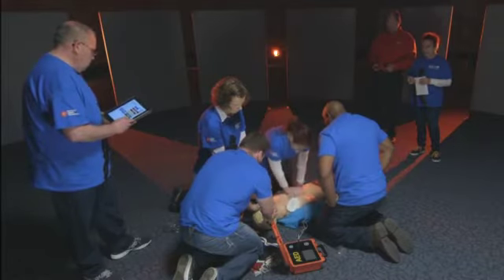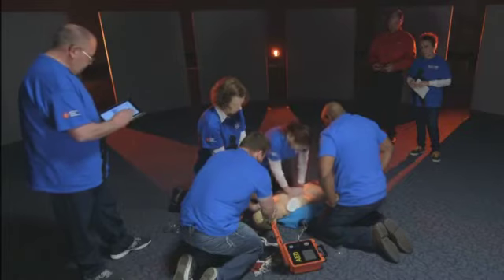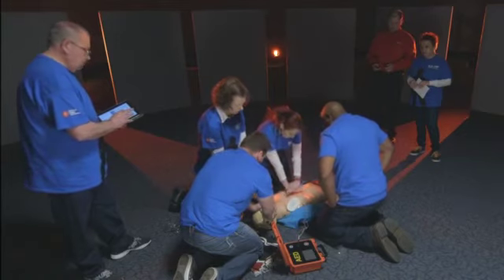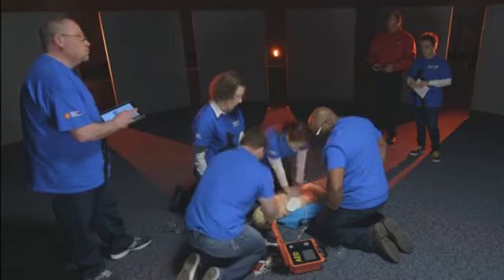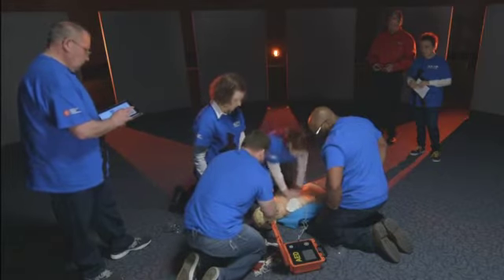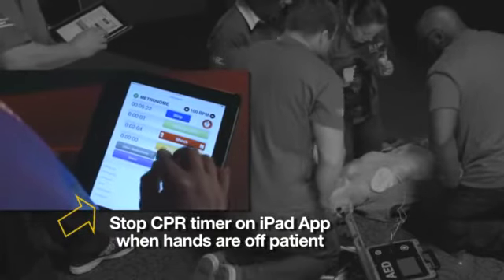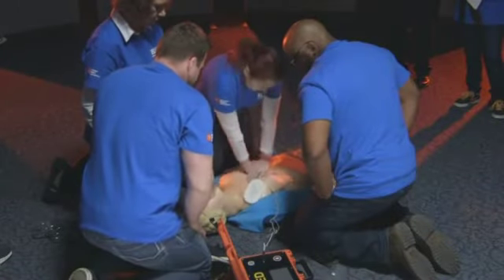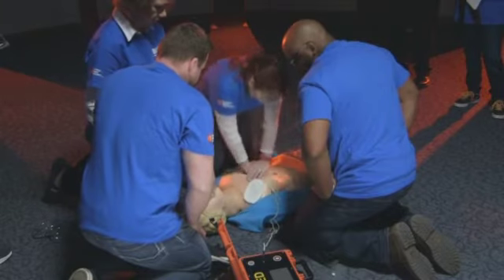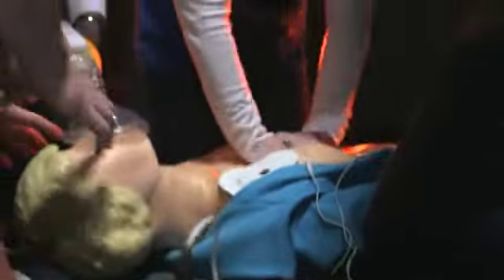Good compressions. Good recoil. Ten seconds to analyze. Analyzing heart rhythm — stay clear of patient, do not touch the patient. Shock advised. Charging. Stay clear of patient. Deliver shock now — press the orange button now. Shock in three, two, one — clear. Shock delivered. Begin CPR.